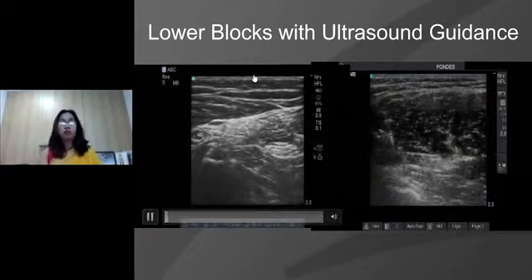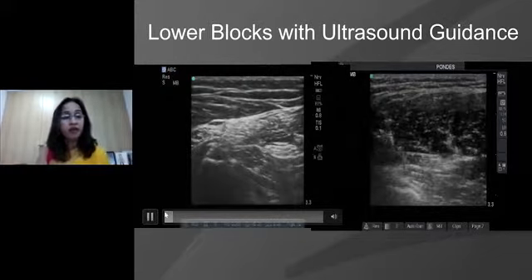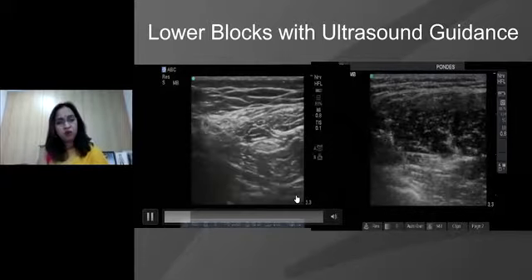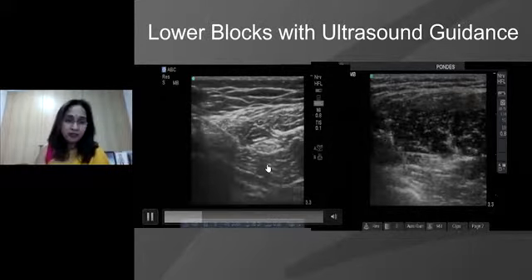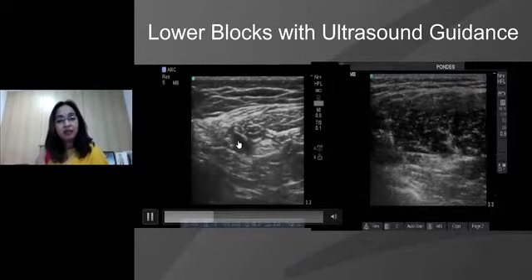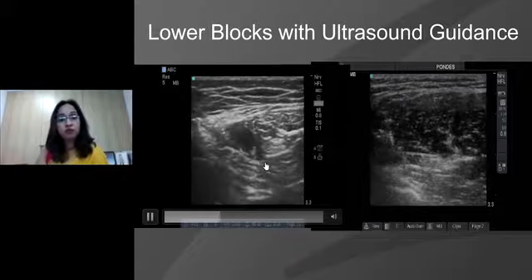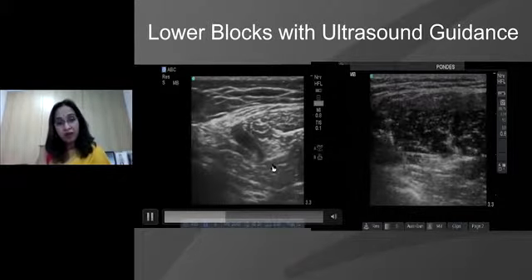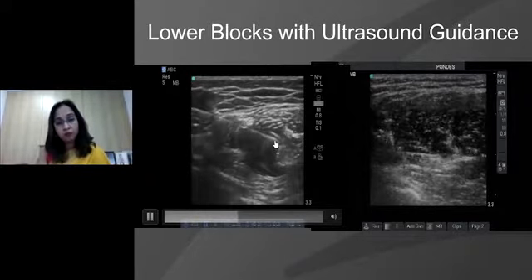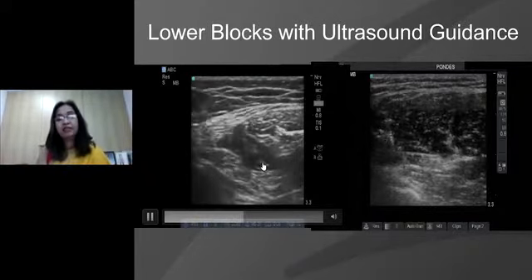So what we see is a beautiful anatomy of this kind. This is the posterior, this is the anterior of the body, and then what we can see is skin, subcutaneous tissue, biceps femoris, and this is a good sciatic nerve. We could have actually done with a lesser depth to see this even better. Now we can see the needle sitting right next to it and the hydrodissection that is happening due to the drug itself. If I may, I might walk to posterior. If I may, I could dissect more on the posterior as well as the anterior aspect.